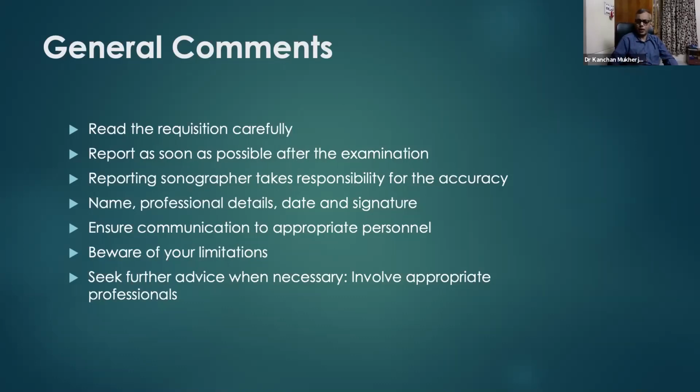And then you have your limitations. As a fetal medicine specialist with obs and gynae background, I do not know how to report gallstones or how to comment on maternal kidneys. Many times, my colleagues would refer that this is a pregnancy ultrasonography. Can you also please check the gallbladder because the mother is complaining of upper abdomen pain? I'm not qualified to do that.